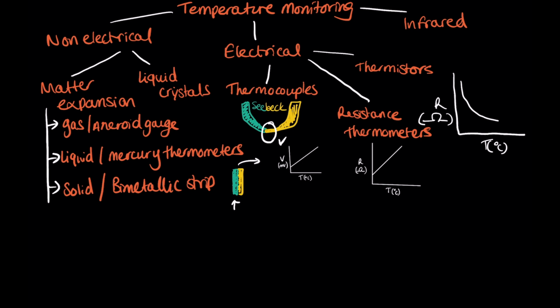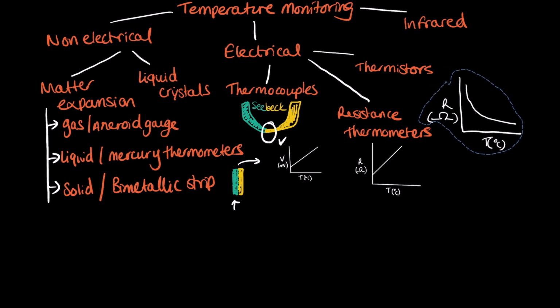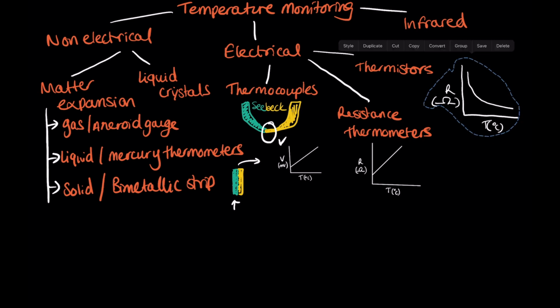This graph has temperature on the x-axis, again in degrees Celsius, and resistance in ohms on the y-axis. Now draw a curve with a negative exponential. This shows that in contrast to the platinum wire, here as temperature increases, resistance decreases non-linearly.